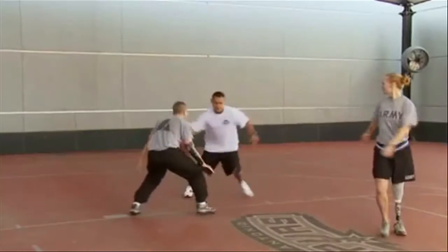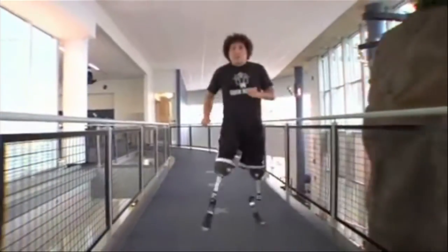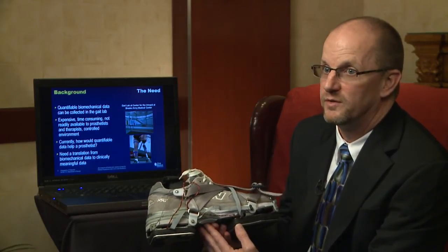Patients can do high-level activities like basketball, jumping, running — anything they want to do, they could do that activity. We even have a limited amount of weatherproofing to the system such that it would survive wet weather.